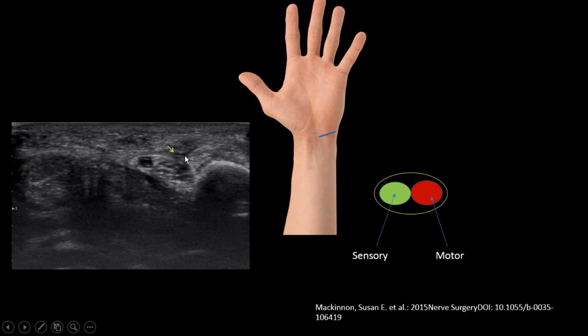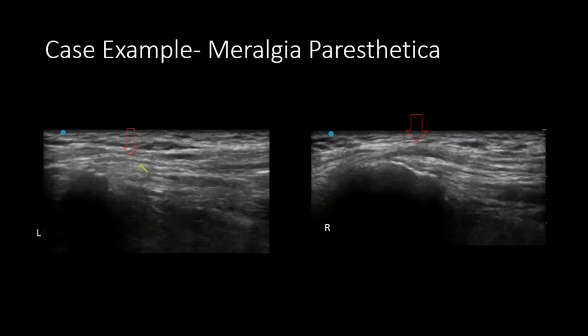So this ultrasound exam explains why the patient has more motor involvement than sensory involvement, because the penetrating injury, the scar tissue, is on the motor aspect and affects the motor fascicles, and sensories were not affected as much, although he has some conduction block, which of course is understandable considering there is scar tissue and there will be some compromise. So ultrasound correlates with the clinical presentation of this patient very well.